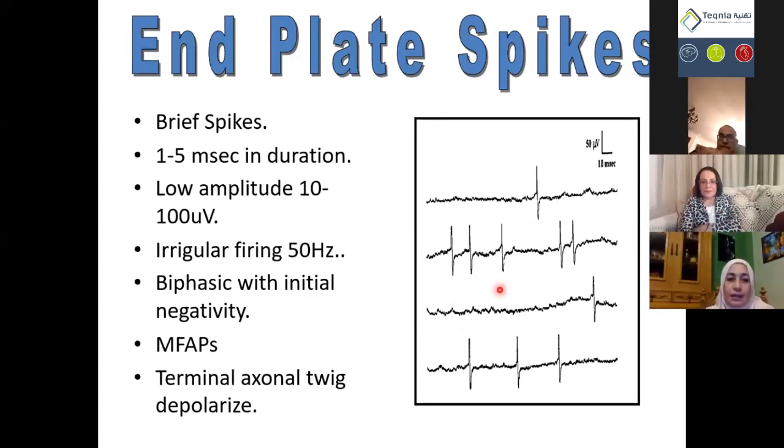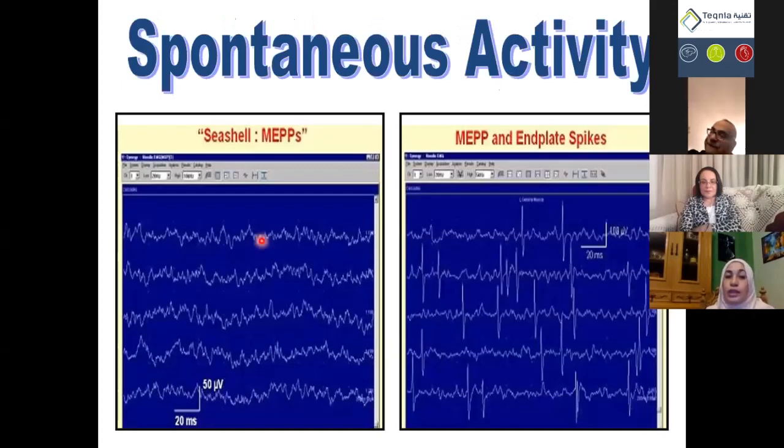Here is end plate noise due to miniature end plate potentials, and here a combination of end plate noise and end plate spikes, miniature end plate potentials, and muscle fiber action potentials, single muscle fiber action potentials. All have a negative beginning, an upward deflection.